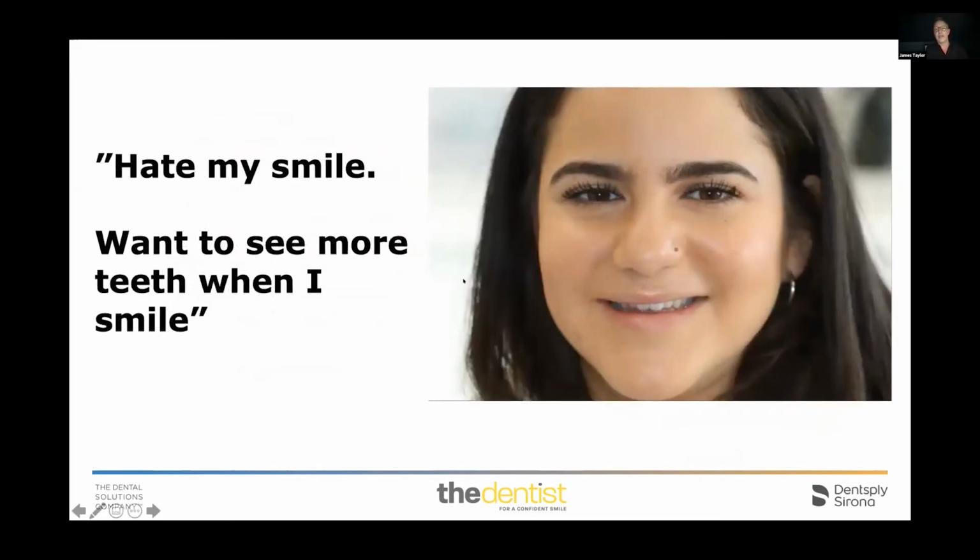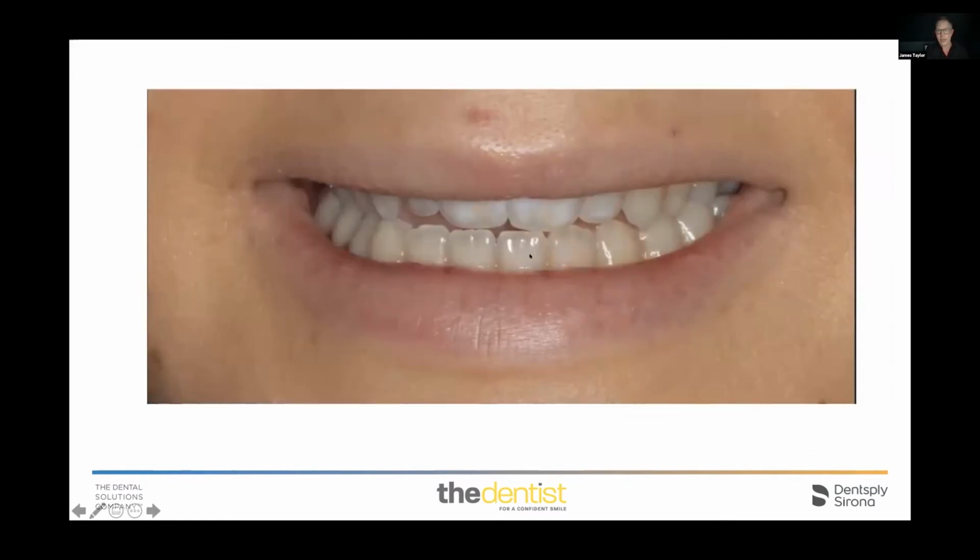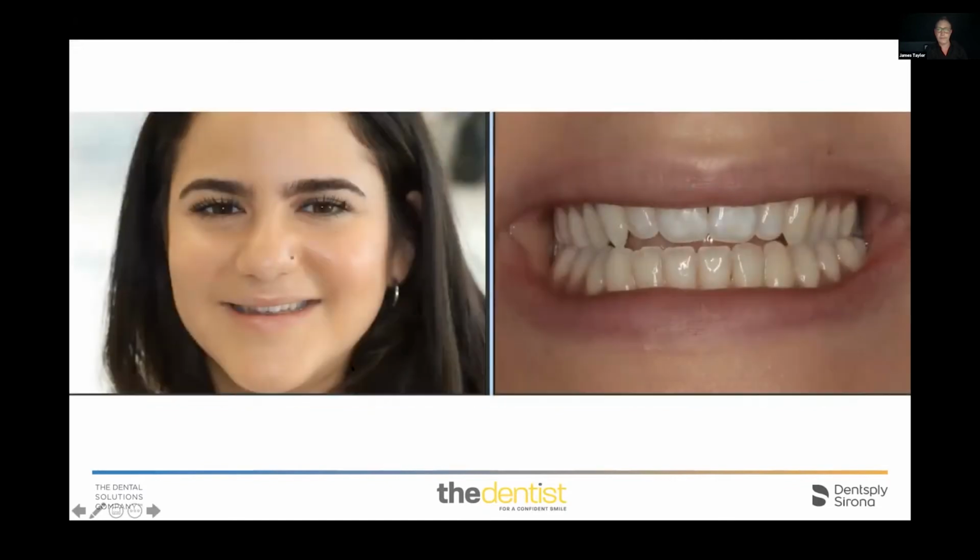Another case, again before CBCT, a lovely result. She had an anterior open bite. She had no lip support, as you'll see from the photos. She had a bilateral crossbite. Actually, the 3 on the right was in crossbite. These were almost edge to edge, but the crossbite was on the left-hand side. With the anterior open bite, she was unhappy with her smile.